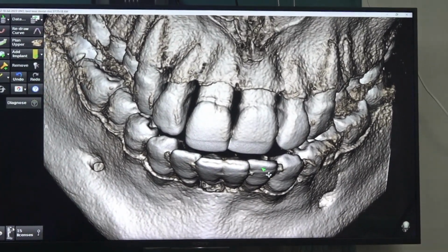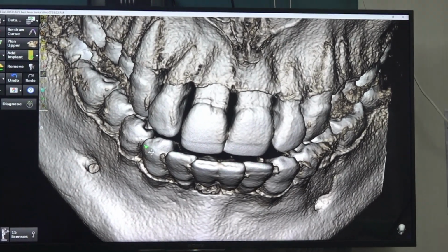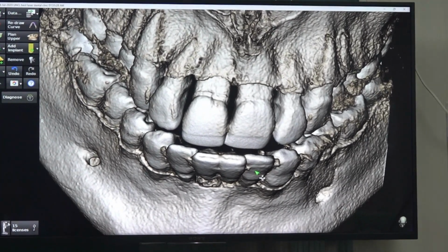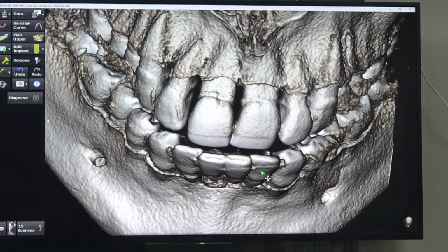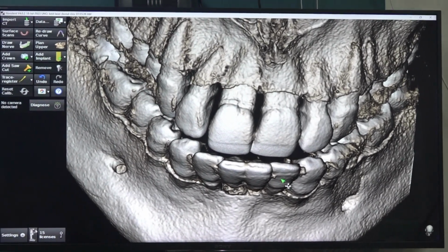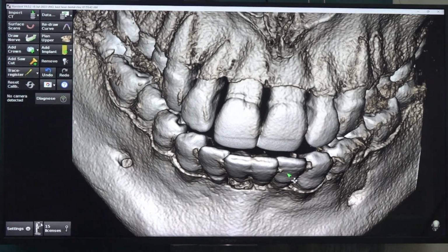Here it looks as though we are going to replace 4 incisors, but they are a little proclined and slight crowding is there, so the mesiodistal space won't be enough for the exact 4 incisors. You may have to give a smaller size 4 incisors or bigger size 3 incisors. The same challenge we will expect when there is too much crowding. There will be 4 incisors, but they will be crowded against each other, but post extraction you can place only 3 incisors.